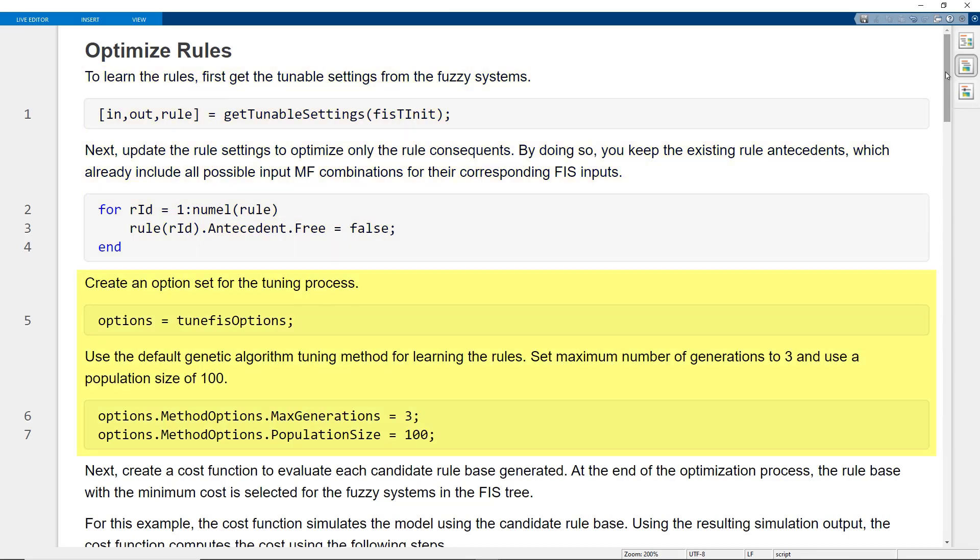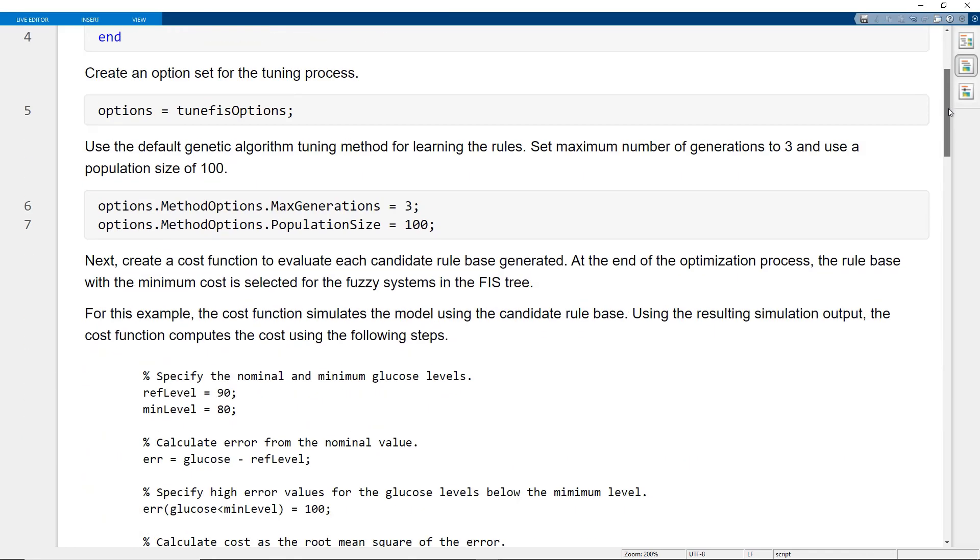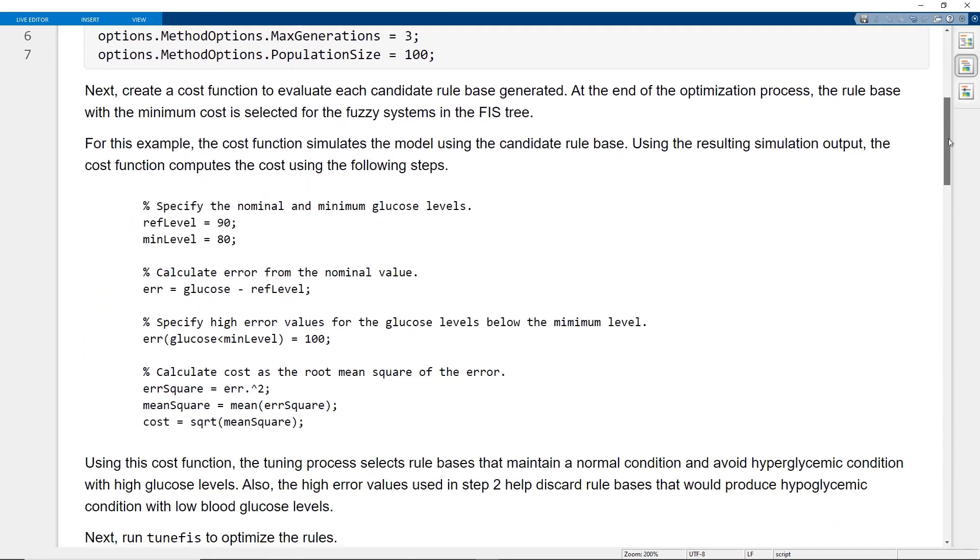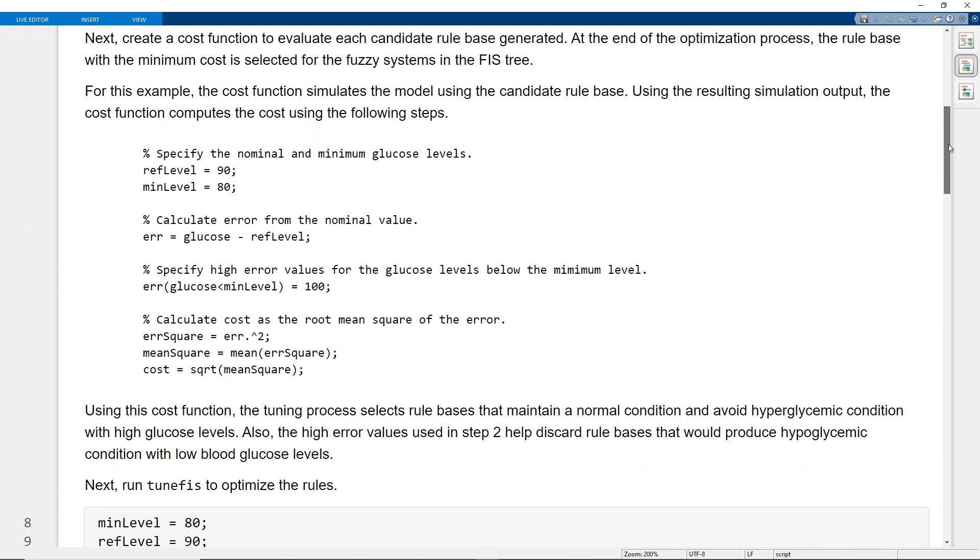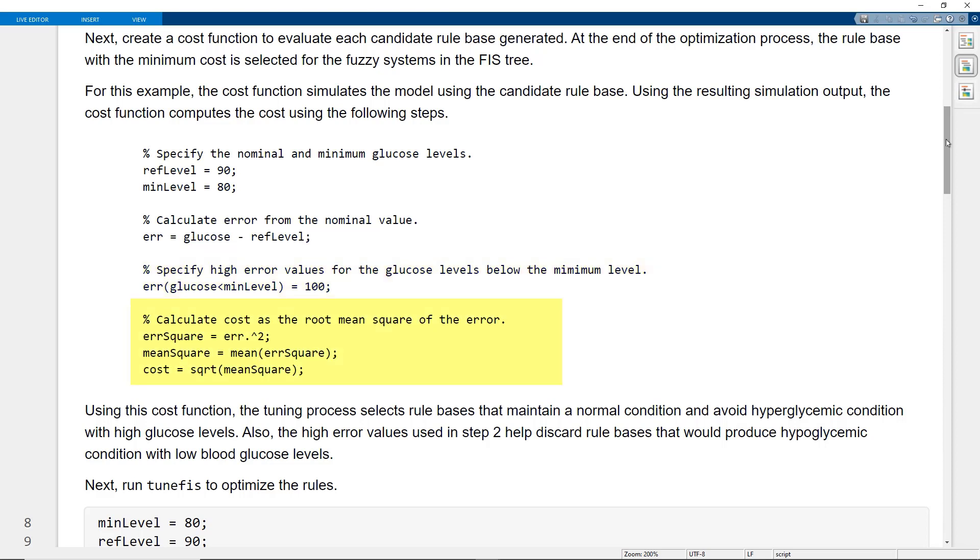Create an option set for the tuning process with genetic algorithm. Create a cost function to evaluate each candidate rule base generated in the tuning process. First, the cost function calculates errors in the observed blood glucose from a nominal glucose level. Next, the negative errors below a minimum glucose level are set to a high error value. Then, the cost is calculated as the root mean square of the error values.